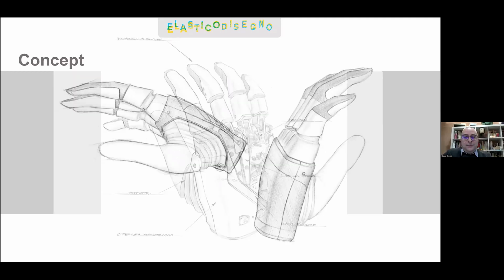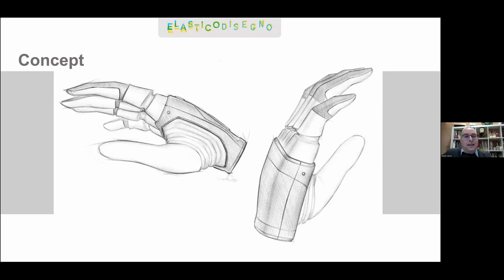This way, it was much easier to fit on the prosthesis for the amputee, and at the same time provides the adequate IP protection. And we also introduced the concept of a user-replaceable customizable cover, which we'll see more about a little later. So the design was able to retain two of the main keys, the main focal points of our project. So have a hand that retains a human proportion, but that still doesn't try to mimic a human hand, doesn't try to look like a human hand, because it's not. And with the added value of an easier to replace glove and possible customization. So the design was the natural consequence of the user needs and of the mechanical performance of this device.